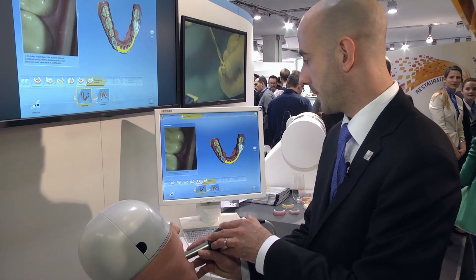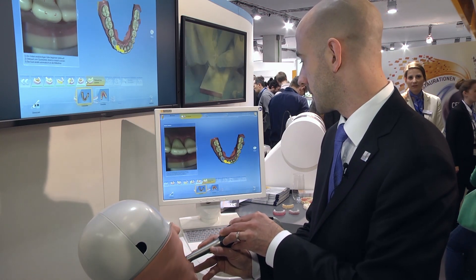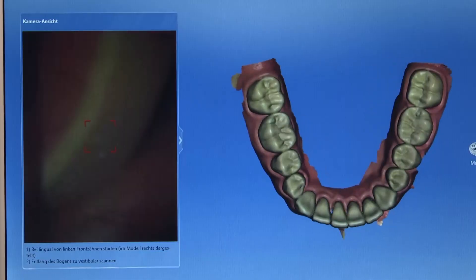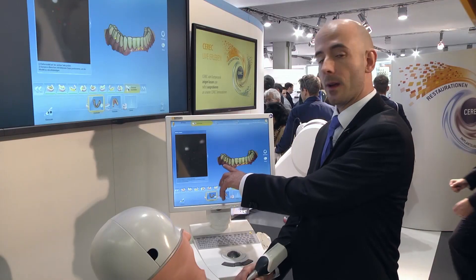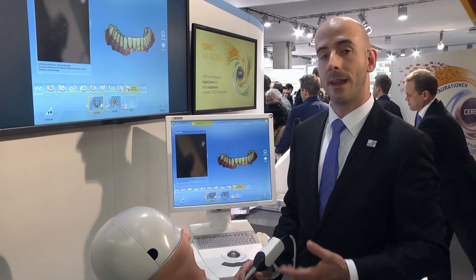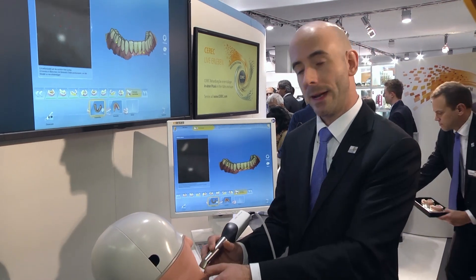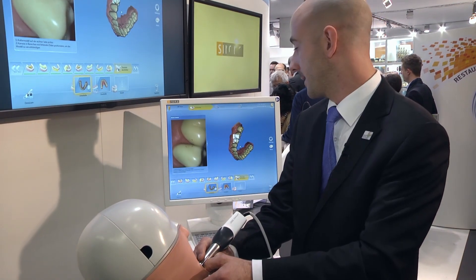We continue with the occlusal. With the scan of the arch finished, the software shows us where there's data missing by yellow highlights, and we can just drop right in and continue scanning data from those points.